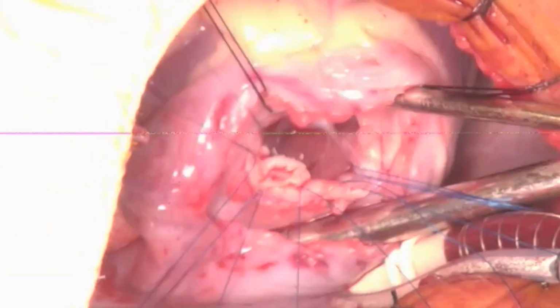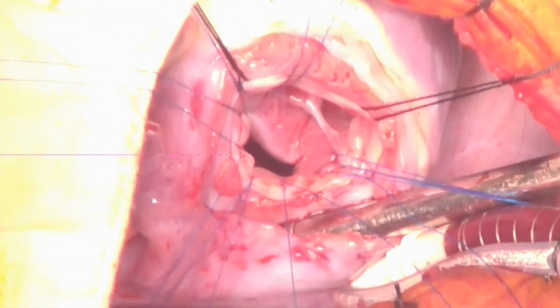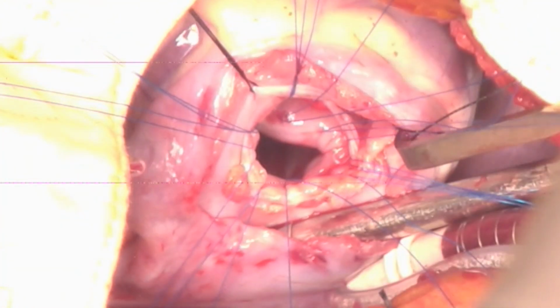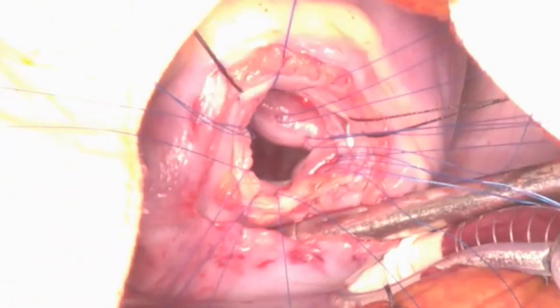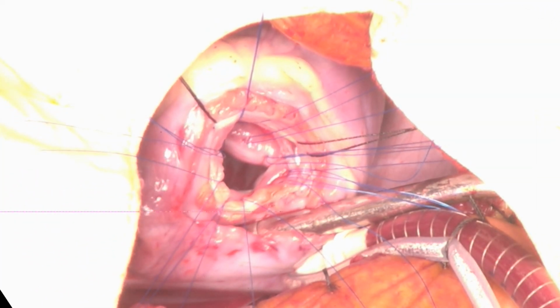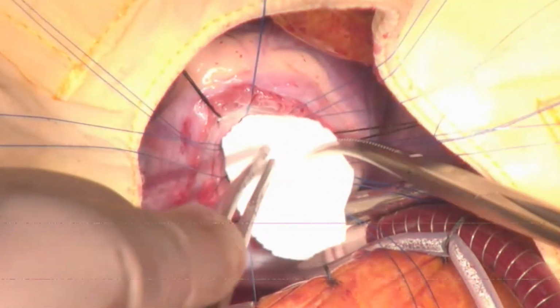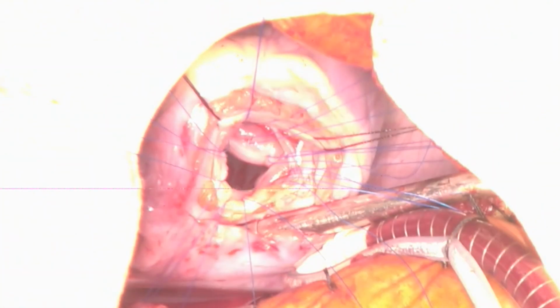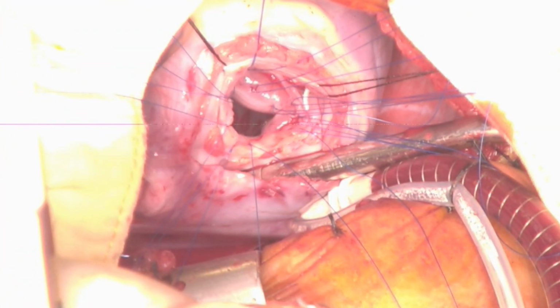The remaining sutures around the margin of the ventricular septal defect are placed entirely within the right ventricle. The Dacron patch for repairing the ventricular septal defect is measured against the defect and then cut to the correct size and shape.